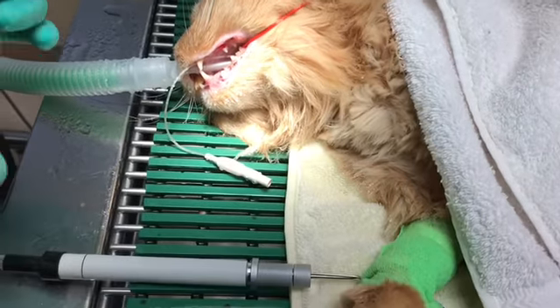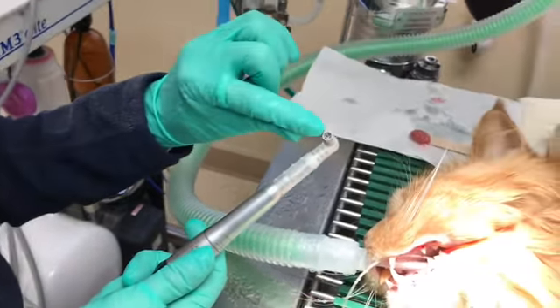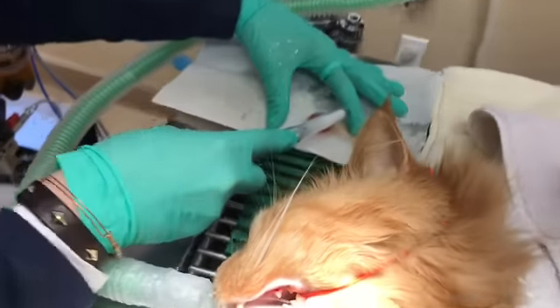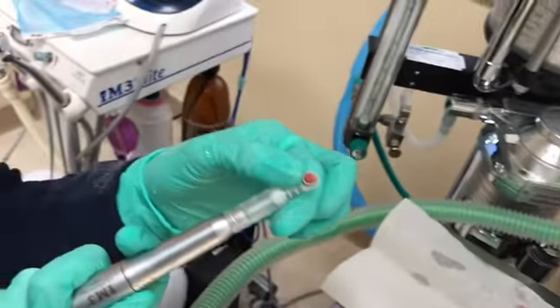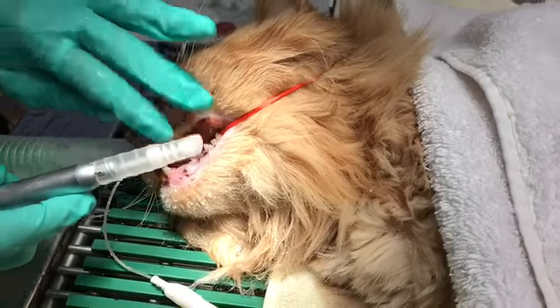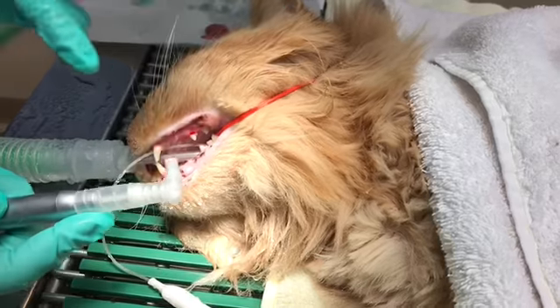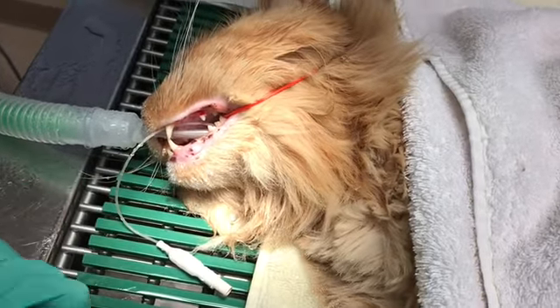Okay, this is the polisher. I'm gonna get the polisher into this cup here. You want to fill it up, and then you brush it on the teeth. You go even up under the gum line a little bit. This polishes away the scrapings you make with the scaler.